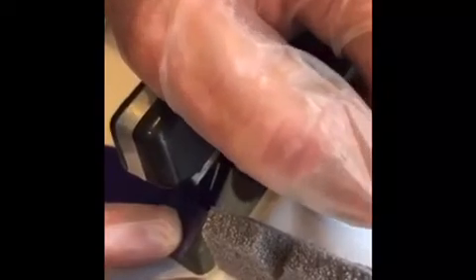Cut elasticated tape 300mm. Align and staple the elastic.